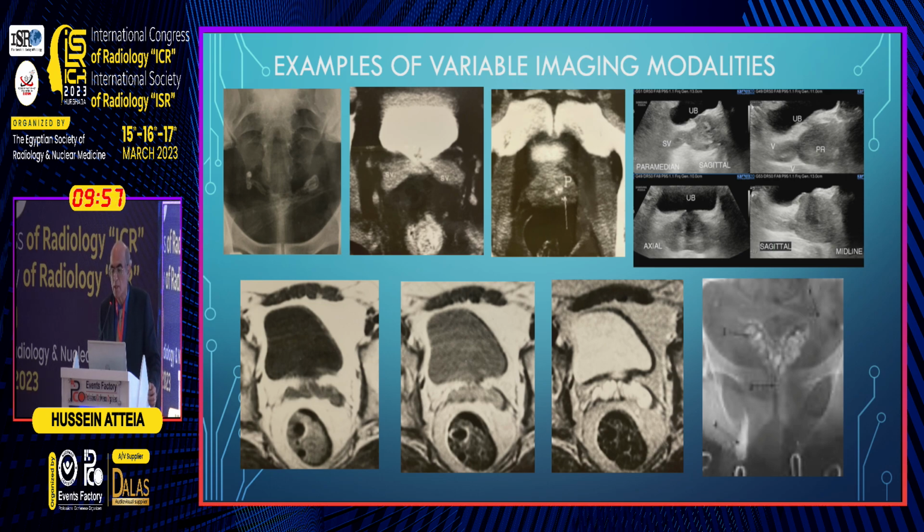You see the prostate, heart-shaped. Posterior to it is the rectum. The peripheral zone is outside, is here. There's the rectum, that's the peripheral zone, that's the anterior. This is calcifications in it.